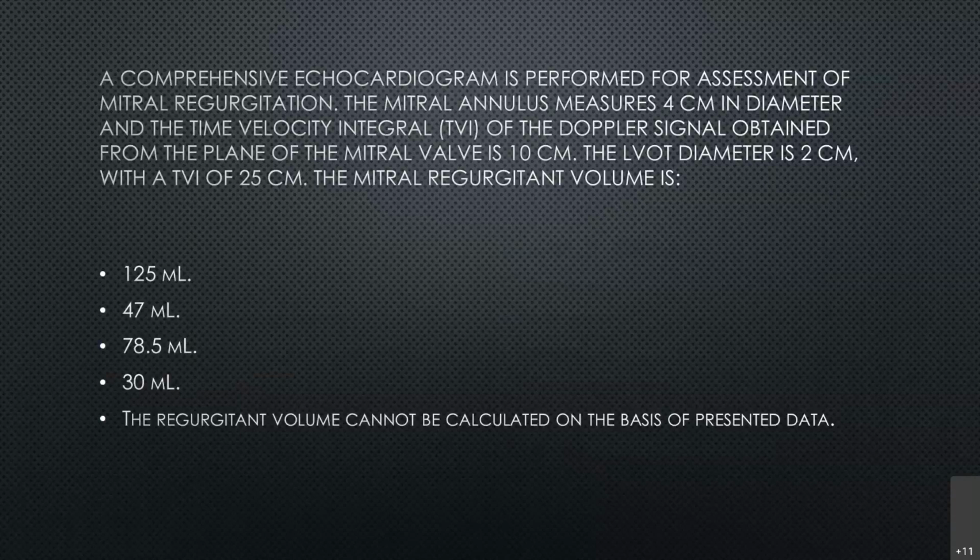Like severe AI, severe MR, AFib, you cannot use pressure half time. So these are again patients who've not undergone mitral valvotomy, younger folks without any other problems. These are the patients that were studied, and that's where the data is coming from. So we should not extrapolate it to current generation degenerative MS. If anybody started on the math on this question, this is on continuity, and I'll explain why this is important for MS. I can do this one, Supriya.